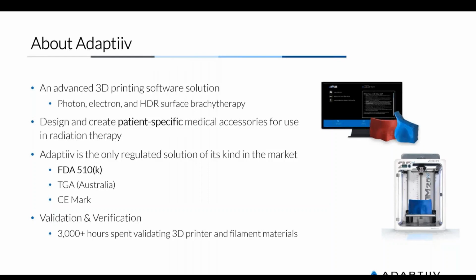We are a regulated solution, the only one of its kind in the market. Last July in 2018, we received US FDA 510(k) clearance to market a 3D printing software solution for use in radiation oncology. And we're the world's first company to have that designation, so we're very proud about that.